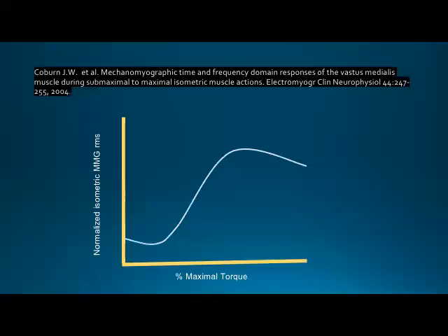if you're holding an isometric contraction, I know most people don't exercise on a dynamometer, but in your mind, in your chair, you're all sitting, you have your legs free. Kick out and contract your thigh muscle and hold it. Try to contract your thigh as hard as you can and hold. Now, the longer you hold that, you're probably feeling kind of tired, right? Does your muscle feel nice and relaxed and smooth, or does it feel kind of hard and stiff maybe? Probably kind of stiff, right? So the stiffer your muscle is, the less movement is occurring and the less sound it's going to produce.